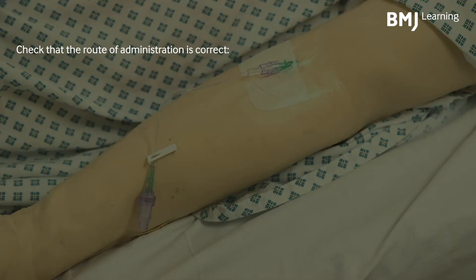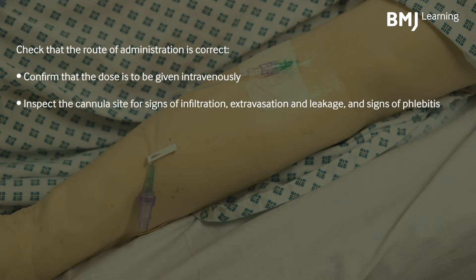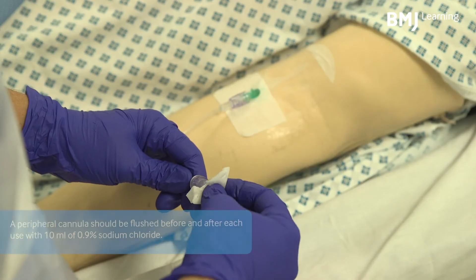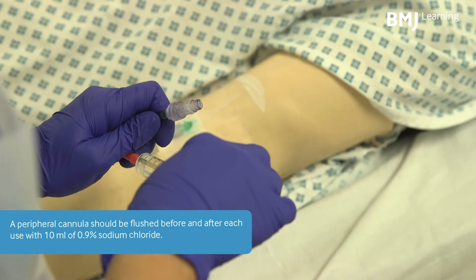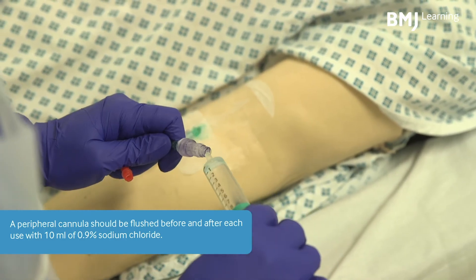Check that the route of administration is correct. Confirm that the dose is to be given intravenously. Inspect the cannula site for signs of infiltration, extravasation and leakage, and signs of phlebitis. Check that the cannula is patent. A peripheral cannula should be flushed before and after each use with 10ml of 0.9% sodium chloride.